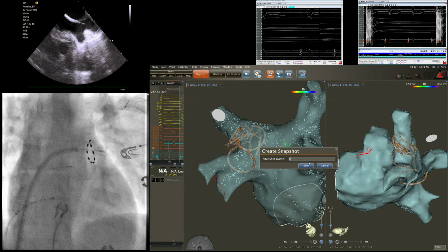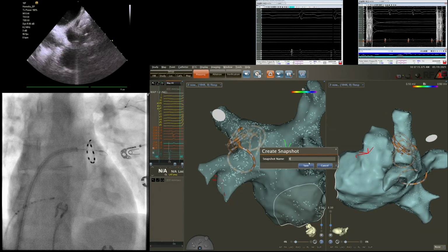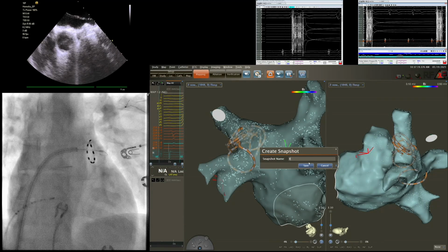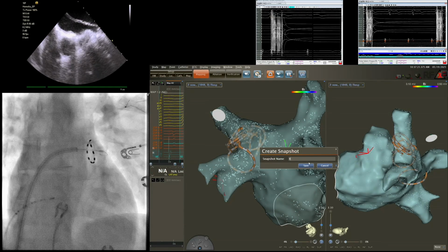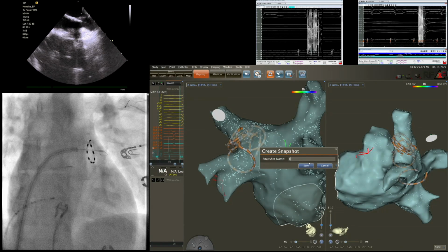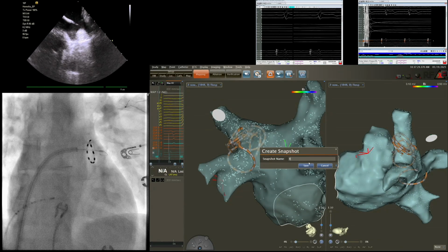Okay, nice. Any comments, guys, or something? You can use a wire to anchor this tool more in the osteum. I would like to show something in the end with anchoring, okay? Yeah, but there is a wire. No, because I'm too deep with this, so I don't care too much.